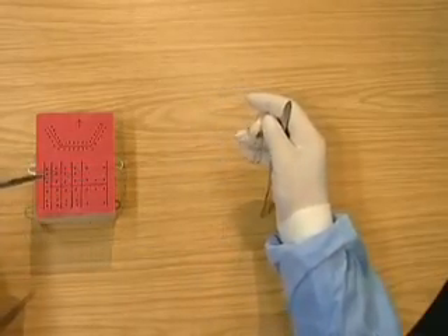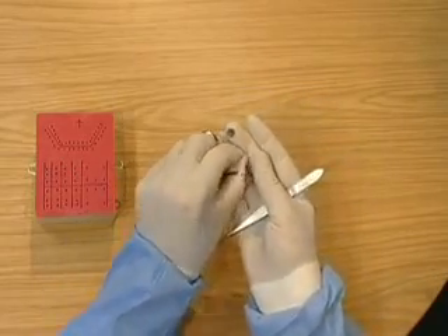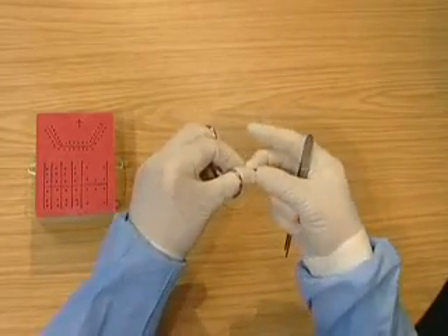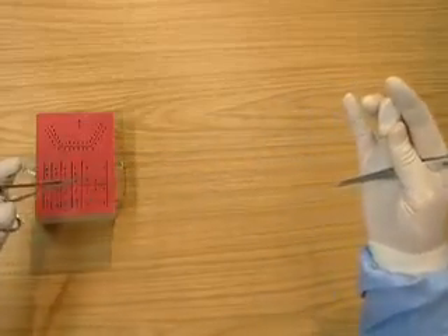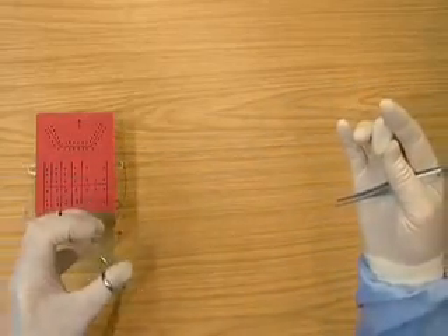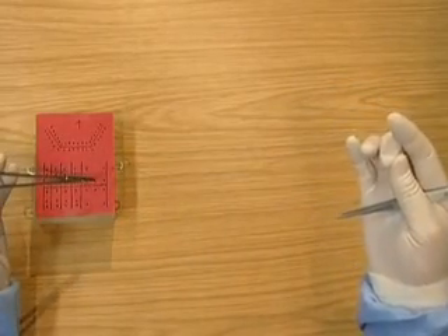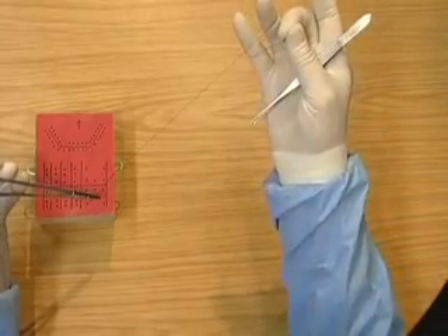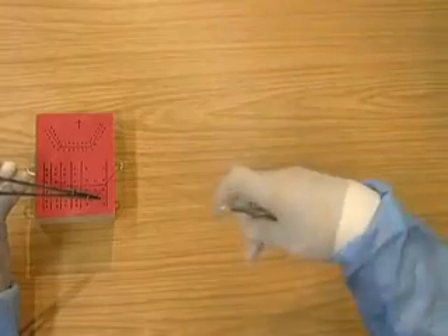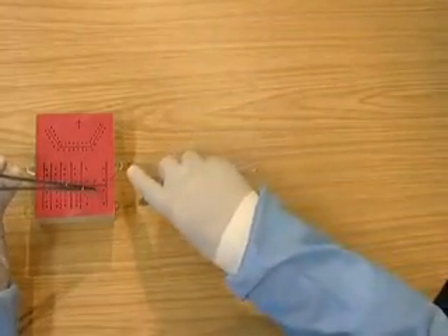Now practice the right hand wind on, ensuring you've got the needle in the correct place and the tissue pickups parked. Hold the other end of the thread with the needle holders in reverse grip, wind on, keeping the third and fourth fingers separate, and using the first finger to tighten the knot.